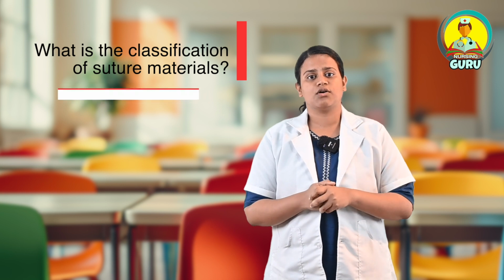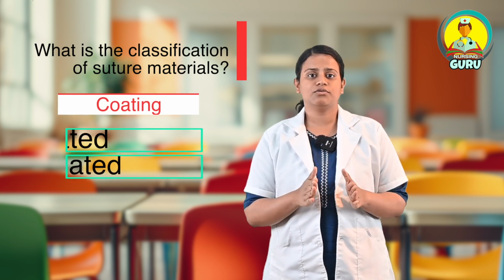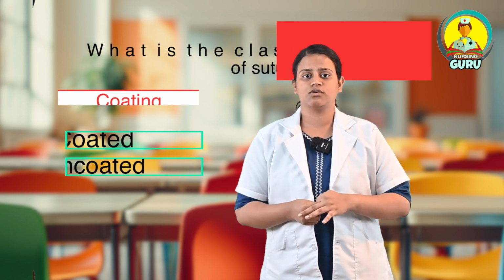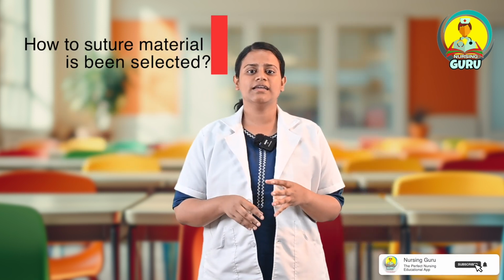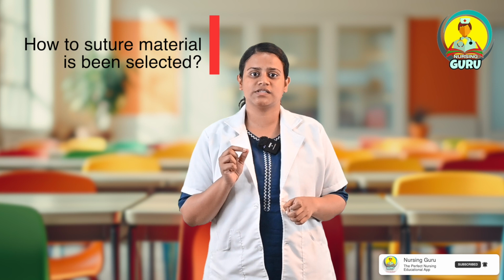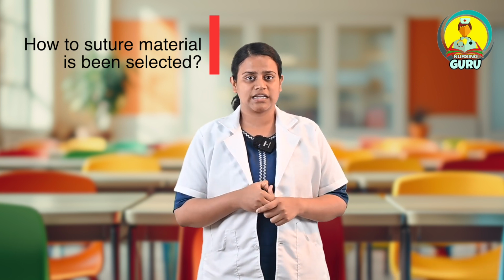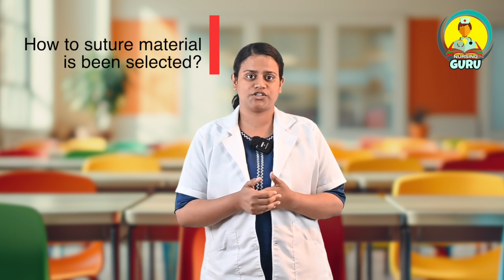Last one is according to coating. According to coating, again there are 2 types. One is coated, another one is uncoated. Next we will discuss how this suture material is being selected: which kind of wound, which kind of affected area, or to repair which kind of tissue.